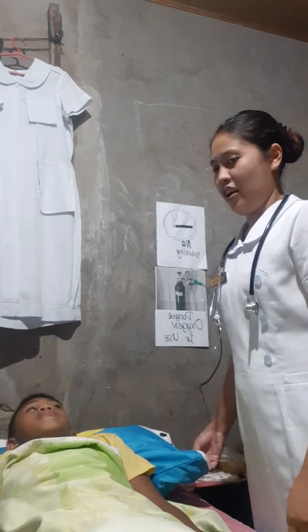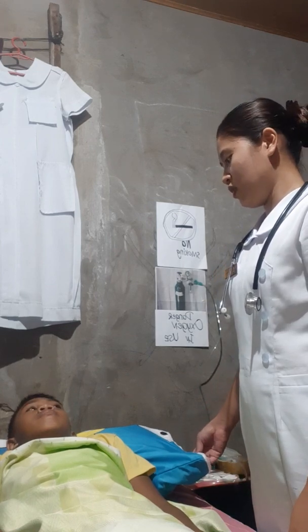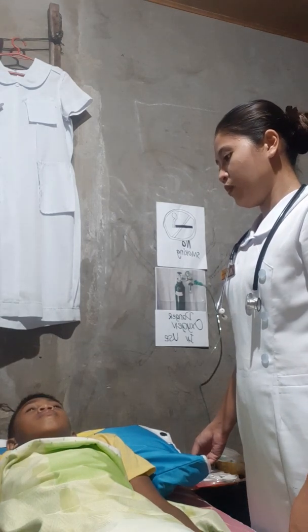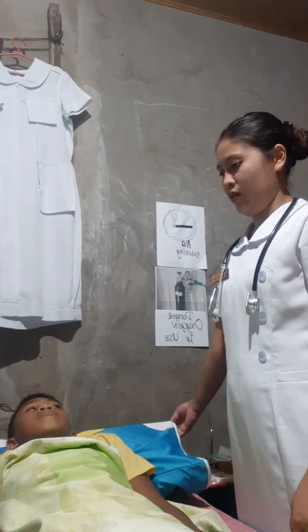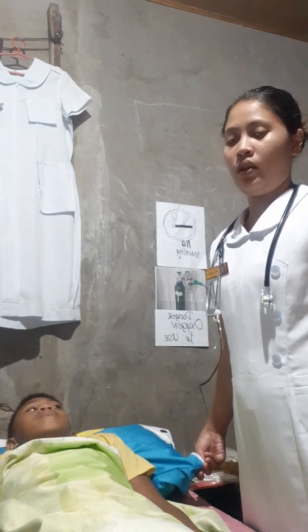Hospital. Okay. This procedure, oxygen therapy, we are going to do, sir, to help you have better lung sounds and to help you breathe easily. I hope you can cooperate with me until the end of the procedure. Thank you. And the next, review for safety precautions when oxygen is used.